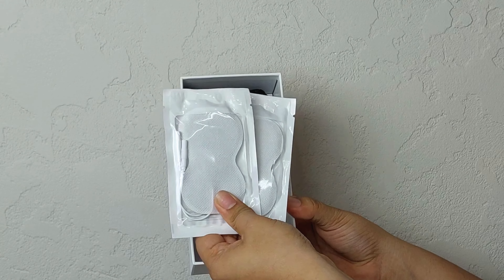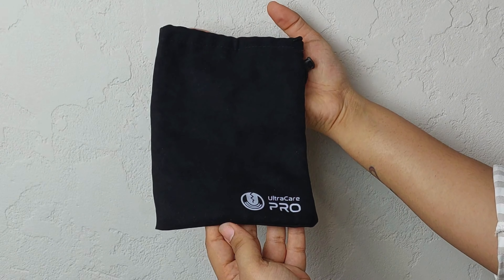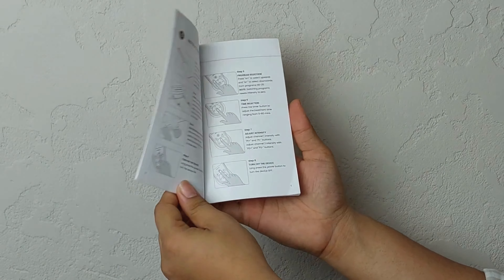Firstly, we have these 4 reusable electrode pads, then lead wires, a USB charging cable, and finally a nice storage pouch to keep the product safe after every use, and not to forget an instruction manual to help you use the product effectively.